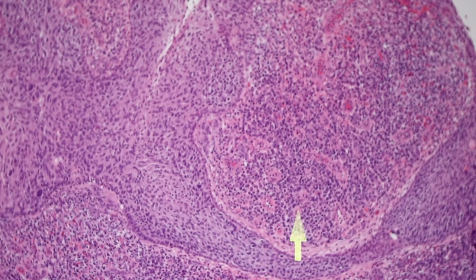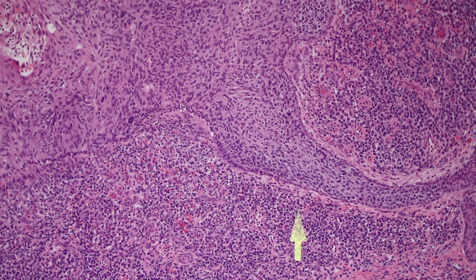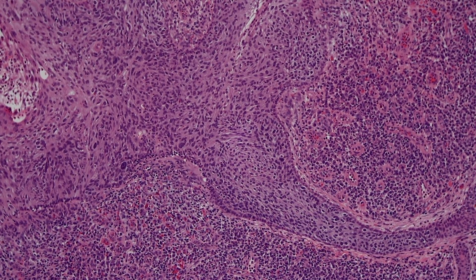The other reason I wanted to share this case is that it shows a nice example of something we call the eyeliner sign. When squamous cell carcinoma starts, it fills up the whole epidermis, and then sometimes it spreads out to the side to involve the normal skin next to where it started. It spreads peripherally into the epidermis, replacing the whole epidermis but tending to leave the normal basal layer intact. From low power, this gives you the look of a line drawn underneath, like a line of eyeliner makeup, or like a kid drew under it with a crayon, however you want to think of it. And if we go closer, you can see.